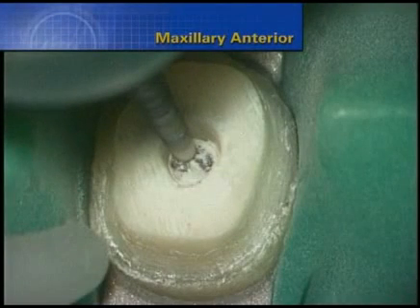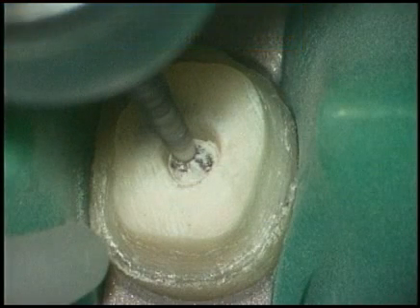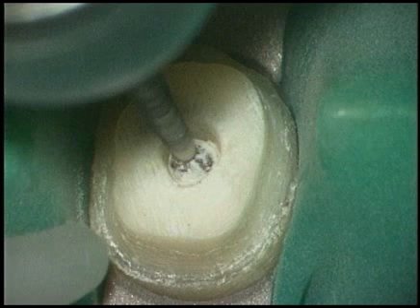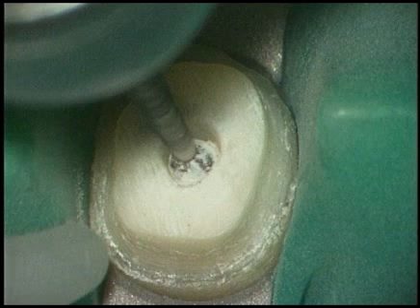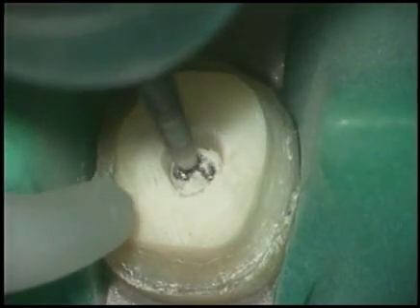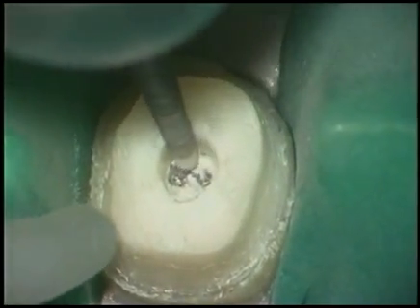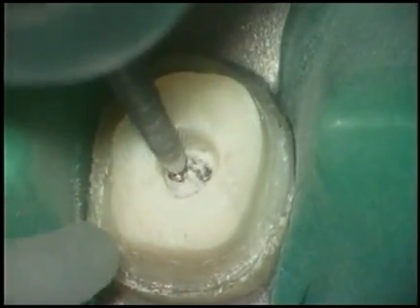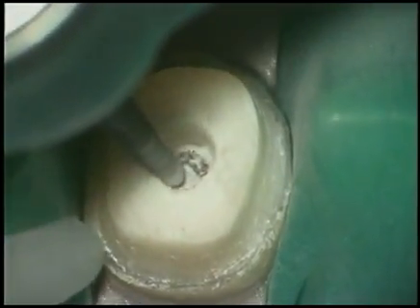It is increasingly common for dentists to encounter broken posts confined within the roots of teeth. Weighing risk versus benefit, we need to remove enough tooth structure to fully expose the post, but yet with an eye towards future restorative procedures. We need to preserve maximum remaining dentin when at all possible. Surgical length diamonds, brush cut circumferentially around the post, flaring the access cavity.